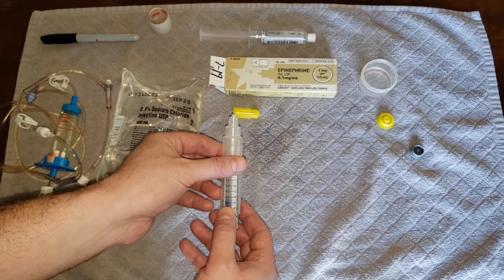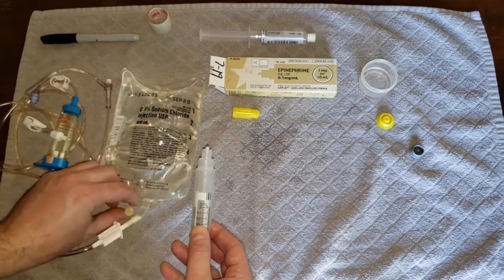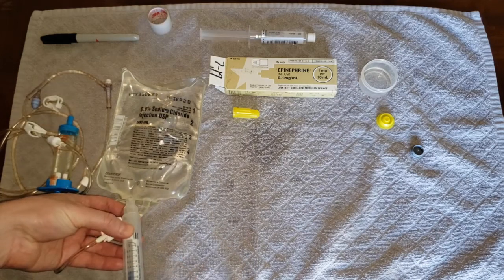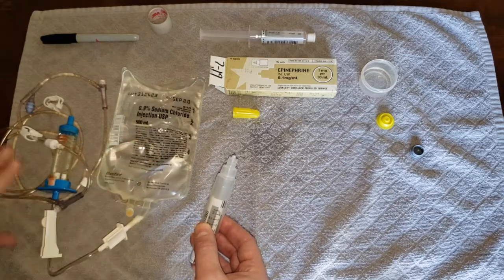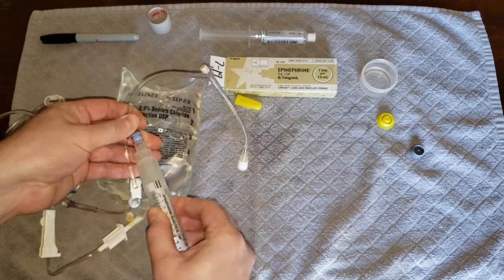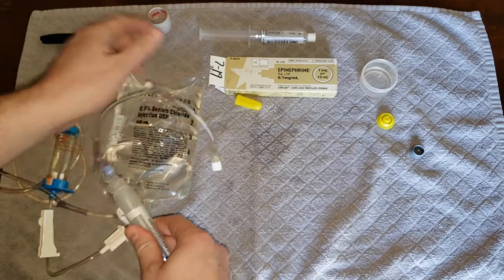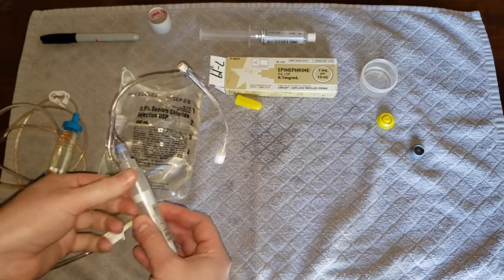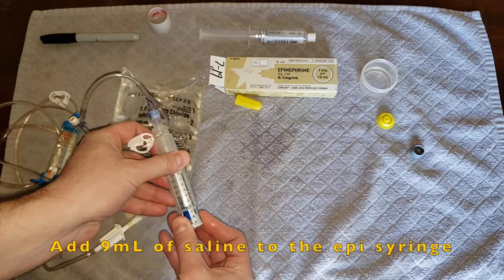There are a couple of different ways that you can do this. You can either attach a needle to your epi syringe and then use the medication port from your saline bag to withdraw nine cc's of saline, or if you already have your bag primed and your tubing ready to go, you can take your luer lock port, attach your push-dose epi — being sure that it's not running to the patient in case you were to accidentally give the undiluted epi. Make sure the roller clamp is open and then withdraw nine milliliters of saline.